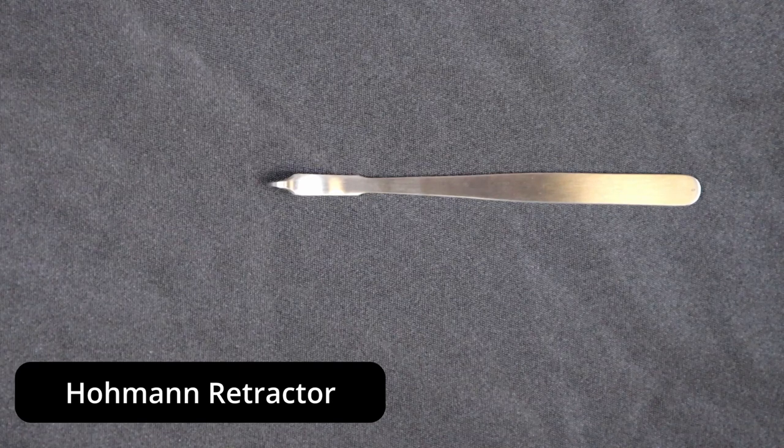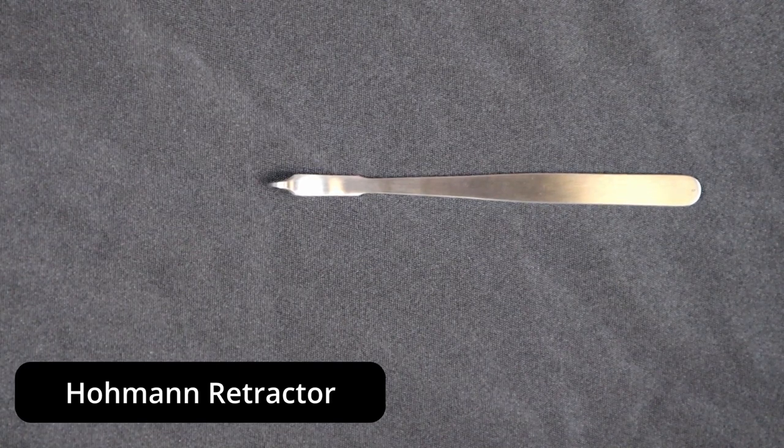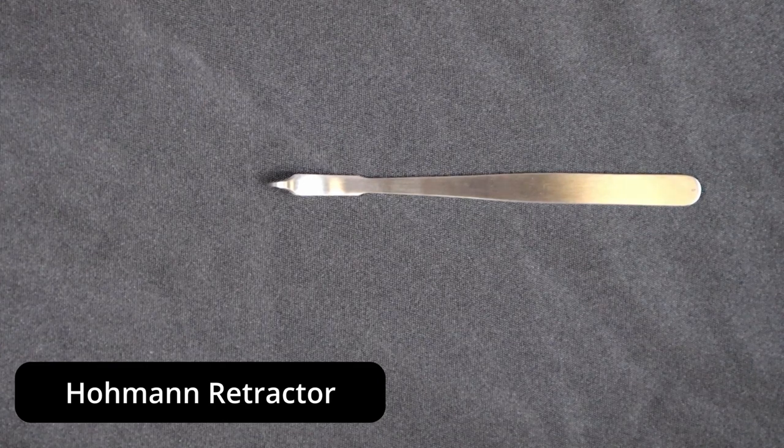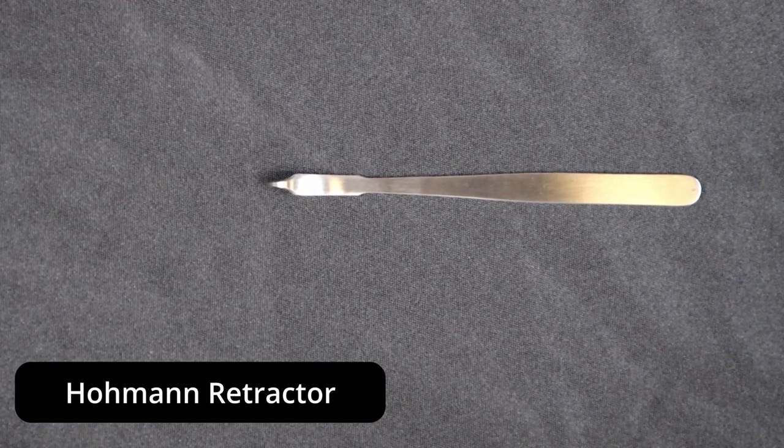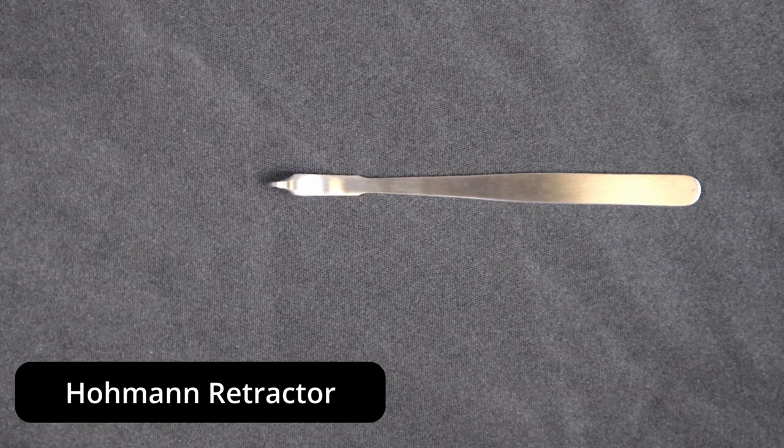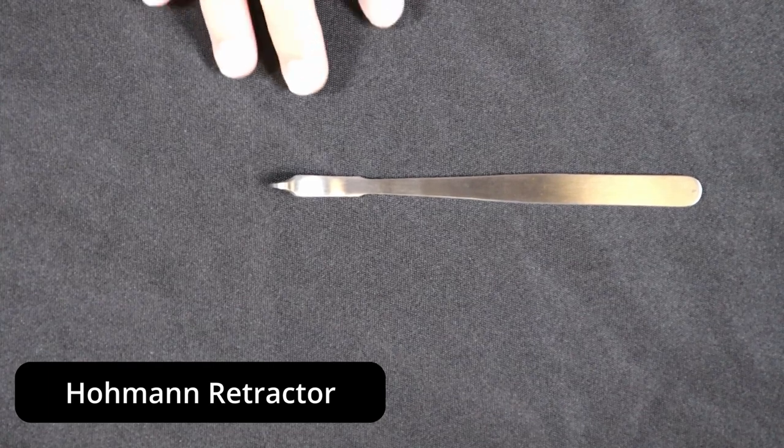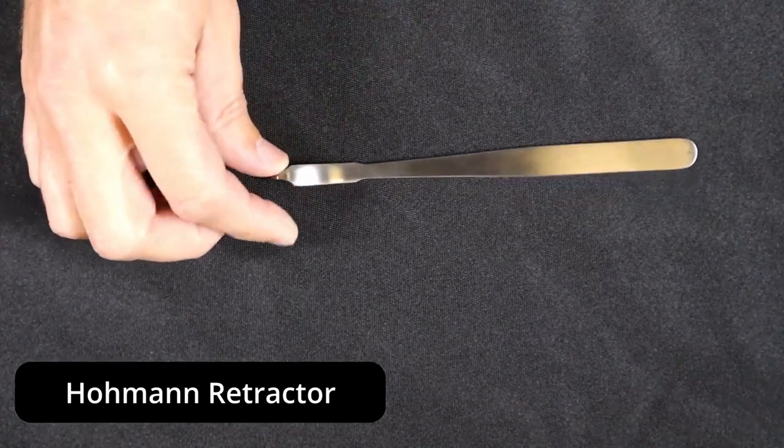You have angles, you have blunt tips, you have other tips that are not necessarily blunt but not sharp either. So it's very important to know what is in front of you as you're processing these Hohmanns in particular.